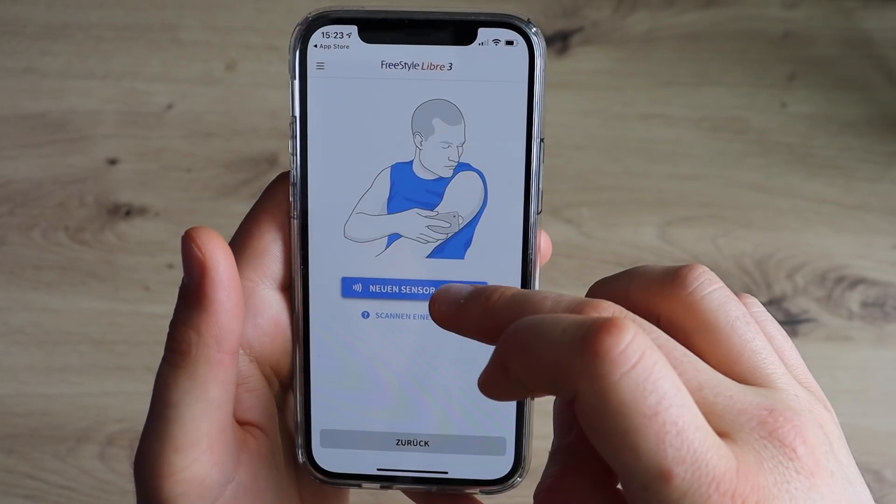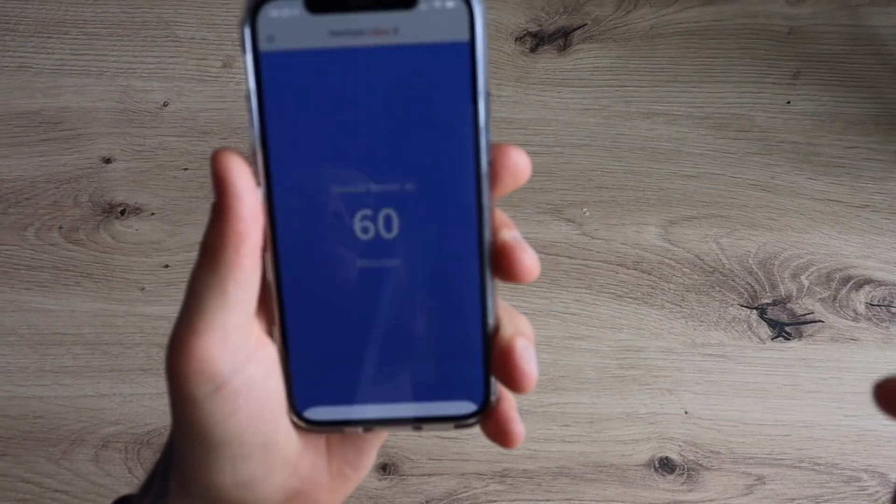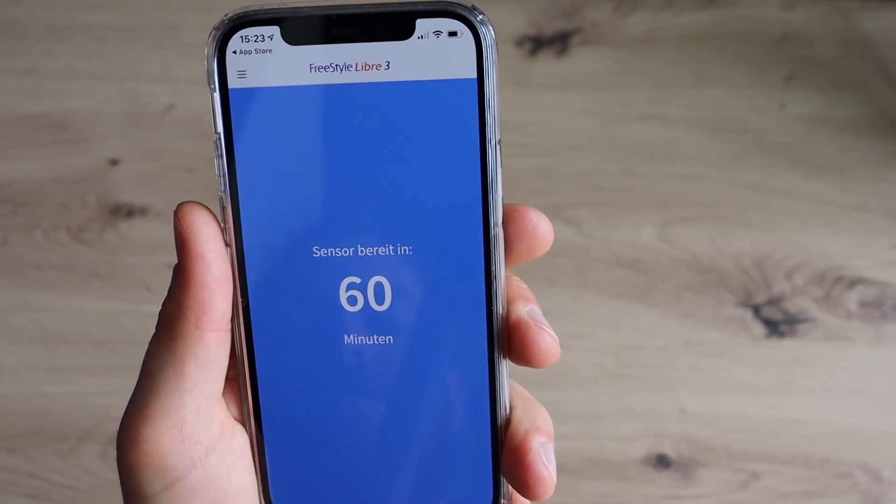So it's so great to hear that with Freestyle Libre 3 you don't need to scan anymore. We will still have to scan once to activate the Freestyle Libre 3 sensor after application and to start the 60-minute warm-up time. But then the data will be fed automatically to the app on the phone. So scanning only once in two weeks — I guess I can live with that. And I'm positive that with Freestyle Libre 3, I'm not going to miss the Libre reader at all.